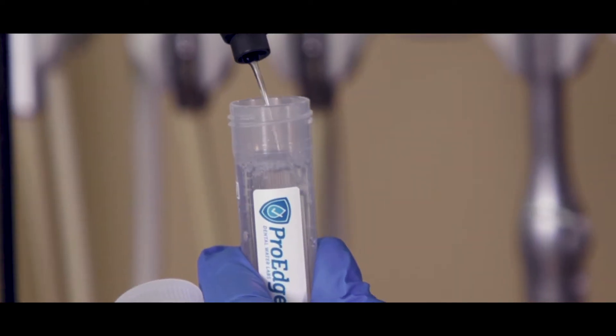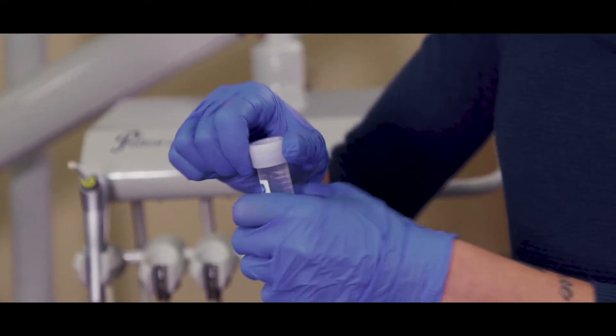Fill each vial almost completely and close the lid tightly. Sometimes the lab receives open pouches and that's not good for anyone. If this is your first time testing, take it step by step and make sure each part is completed.